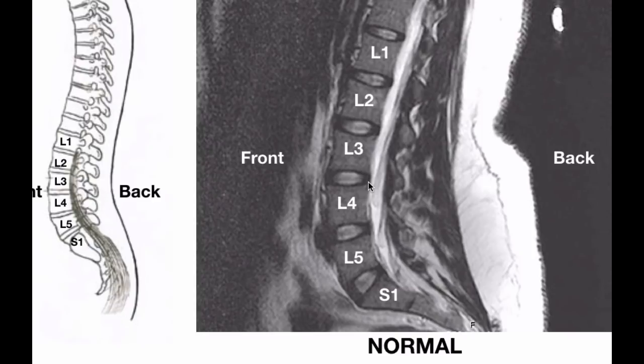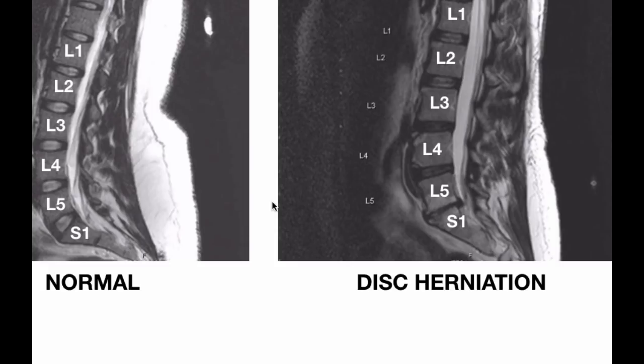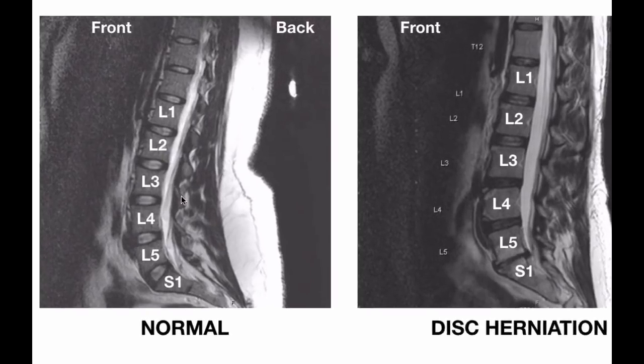And because the nerves in the low back travel down to the legs, sometimes you may feel pain radiating down your leg, as is the case with sciatica. When a herniation hits the sciatic nerve, then you can feel pain traveling down the leg. So this is what a normal MRI would look like. Now we're going to compare a normal versus one that is not normal. So here we go. So this is normal. This is the same one I just showed you.